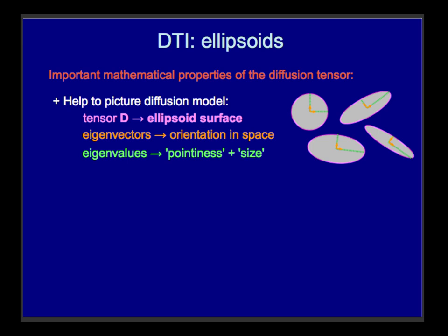So that's what these orange arrows represent. So this is a two-dimensional object. It has two axes we could rotate around. And in 3 dimensions, it would have a third one, in this case, sticking out of the computer. And the eigenvalues tell me how pointy the ellipsoid is in a given direction of the major axes. Okay, so a special case is a circle, or in 3 dimensions, a sphere, and these dirigible type things.